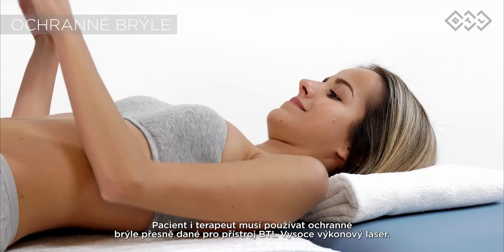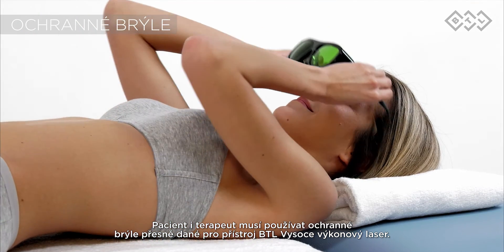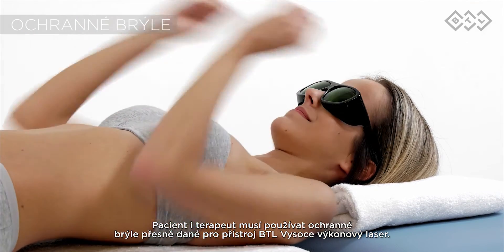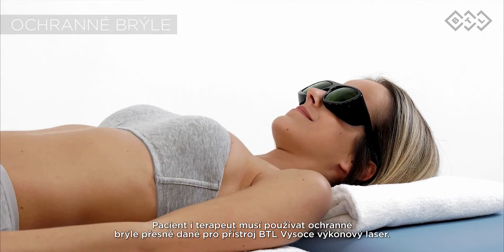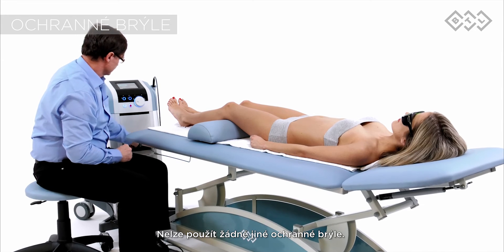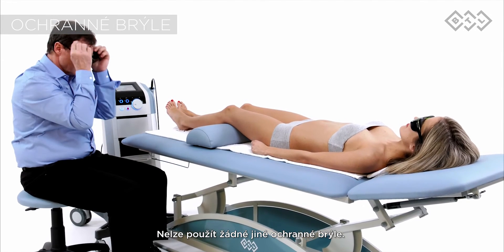Both the patient and the therapist must be wearing protective eyewear suitable for the BTL high intensity laser. No substitutes for the eyewear provided by the BTL company are to be used.